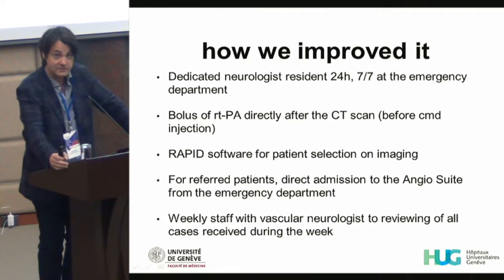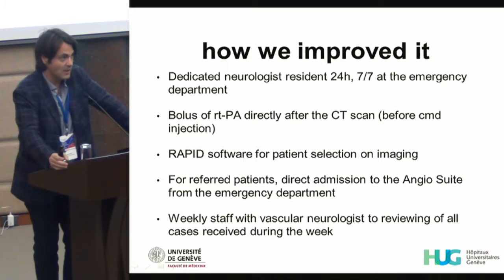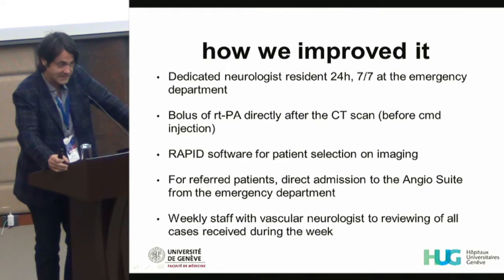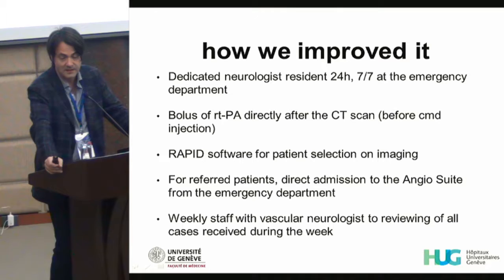Then we have automated software for patient selection. It's not the only tool we use, it's just one other tool, meaning that we have different arms against stroke, and automated software is very helpful, an additional tool to select patients.